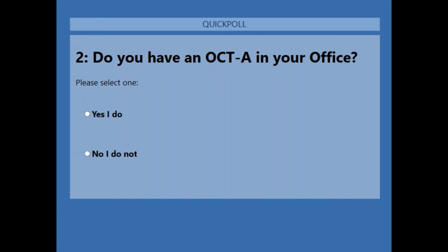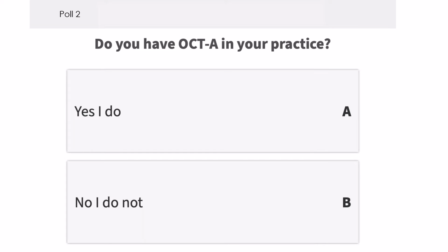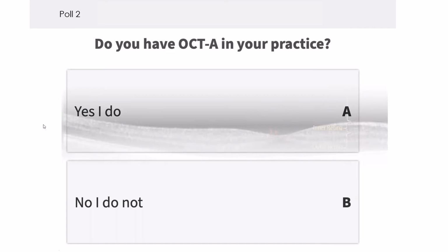Let's go ahead and show the responses to this, or we can shut down the poll. And I'm going to guess it's going to be 5 to 10% say yes. But Adam, am I right or wrong? So you would be shocked because we have a very high-tech audience here today. So 20% yes, 80% no. There you go. So we go from 60% of OCTs down to 20% of OCTA. That is one of the highest percentages that I've seen with OCTA. So obviously a very progressive group that are practicing out there. So let's continue on. And you have to give me control back.